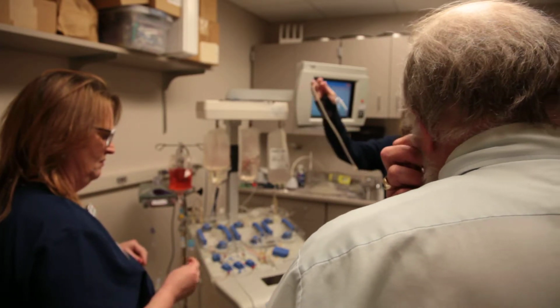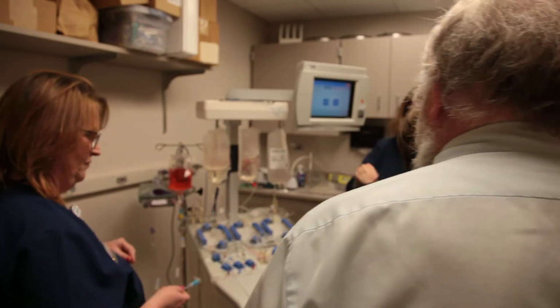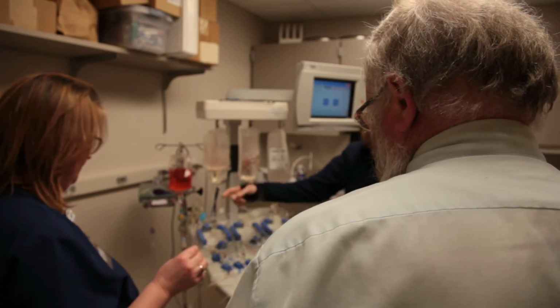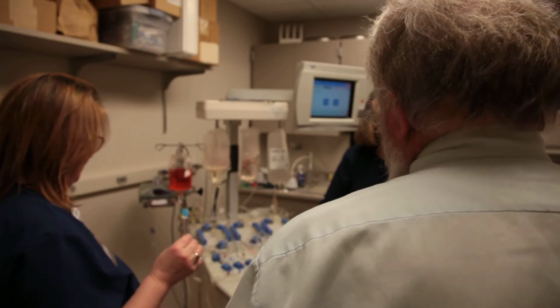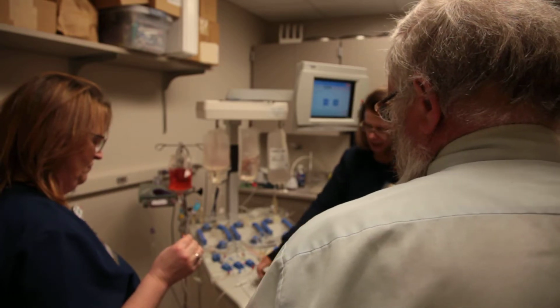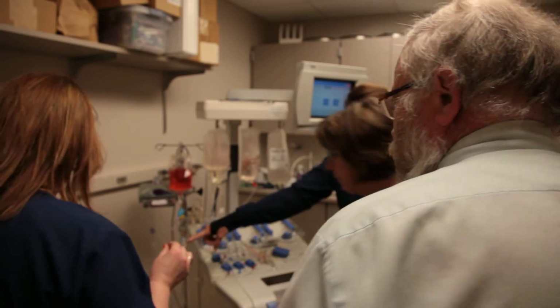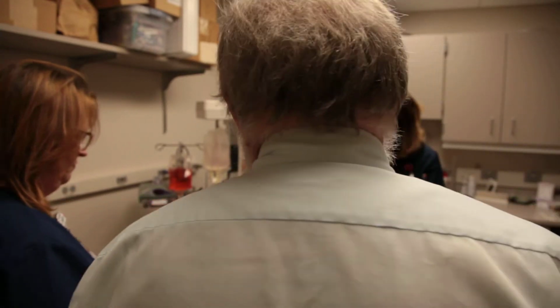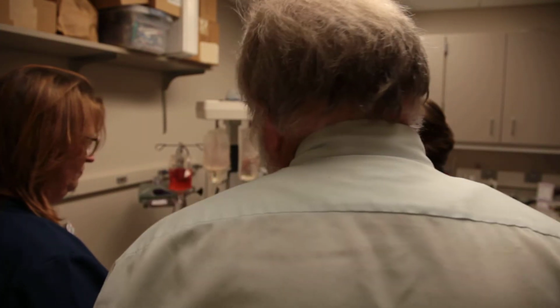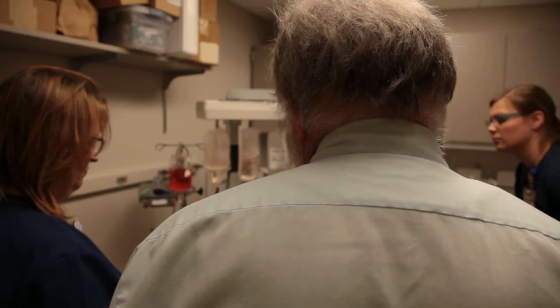So here we have your transfer pack. We heat seal these things off, just to get rid of that. And that's going to be the bag that you're going to return into. Pretend that's our blood bag. Or is that our return? That's your return. Yeah, we're going to return into this. And the nice thing is now, we've got one over there, you can just bring that one over. We use those spikes, and now instead of those little alligator clamps, we have these nice little blue knobbers and they screw right on there.